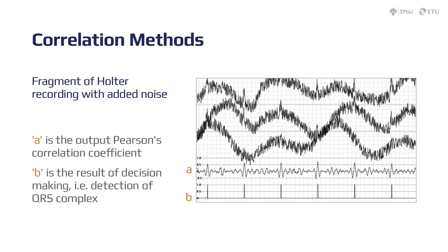Signal information is lost after segmentation. There is an inability to take into account all variants of the ventricular complex structure, and a susceptibility to unexpected changes in the result of the analysis with insignificant random deviations in the form of the input signal.